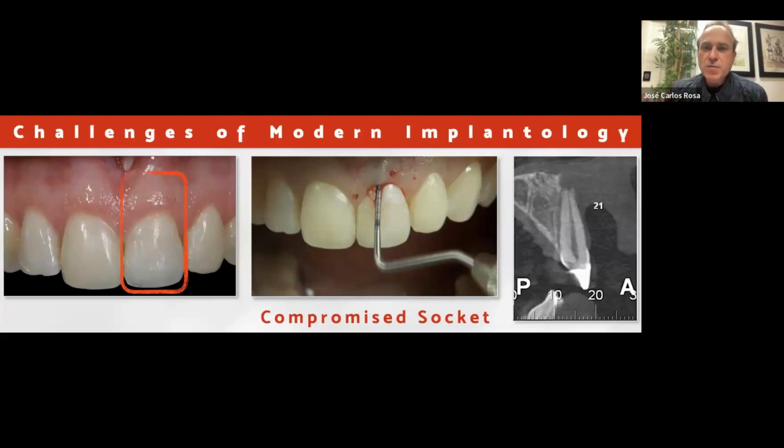Most of the literature would recommend that we perform guided bone regeneration in combination with membranes, and we would close the flap again. This is the second surgery, and we would wait, this is what they recommend, between 6 to 9 months to do the third surgery. What's the third surgery? Implant placement, and maybe in the third surgery we would add some extra bone in order to improve the thickness, or the thickness and height, for vertical and horizontal augmentation. Sometimes it's necessary.